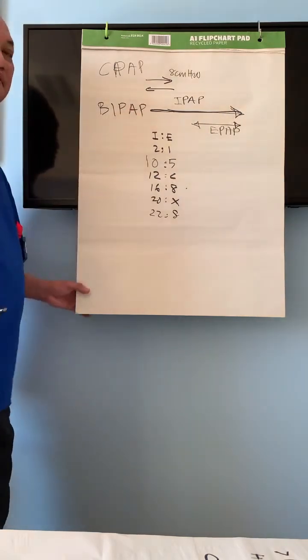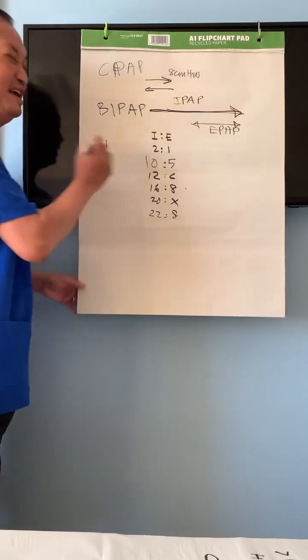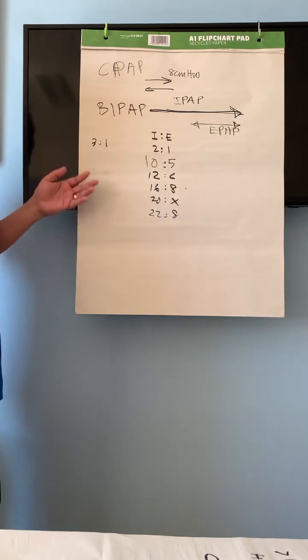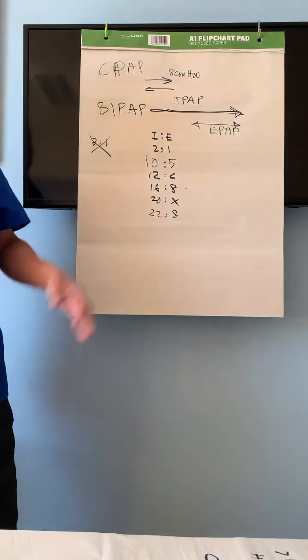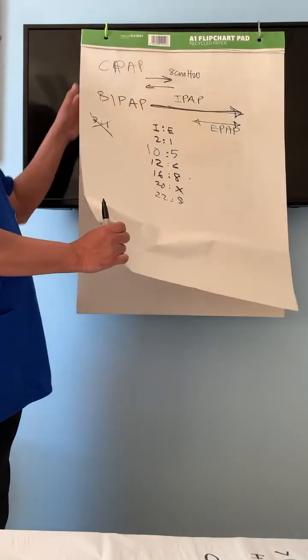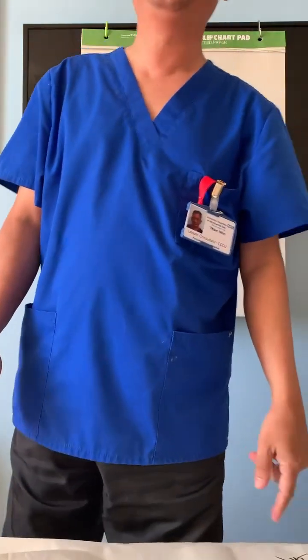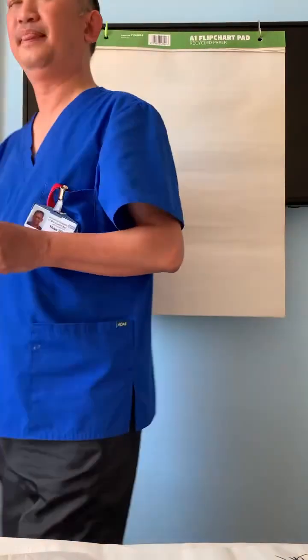But sometimes in the British Thoracic Society guidelines, some may say you can go 3:1 in very obese patients, if the chest is very big and tidal volume very big. But for a roughly general setting, we won't use 3:1. We use a 2:1 ratio. Now I will go to how to adjust BiPAP and what are the indications to start BiPAP. This is going to be a little important and busy slide, but I will try to make it clear.